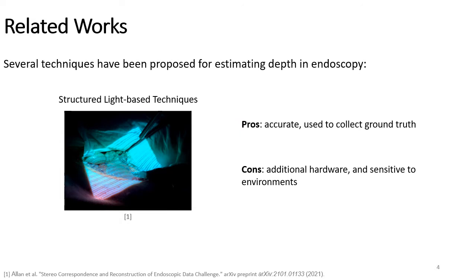There are several ways to estimate depth. Structured light is the most accurate way, which is usually used to collect ground truth. However, it requires additional hardware and is sensitive to environments, making it hard to incorporate in real surgery.